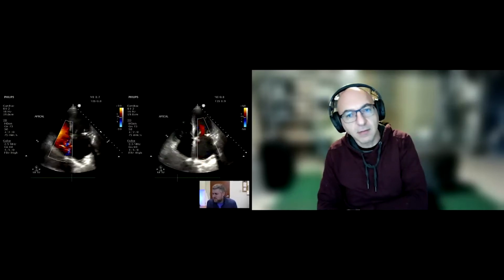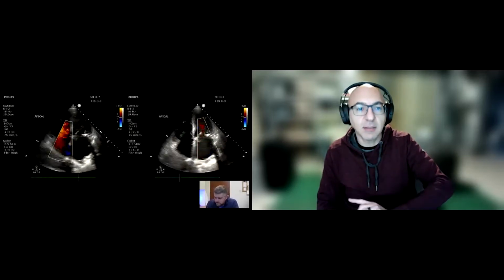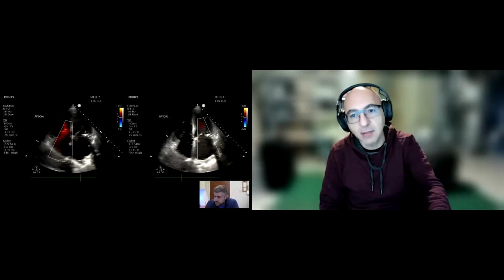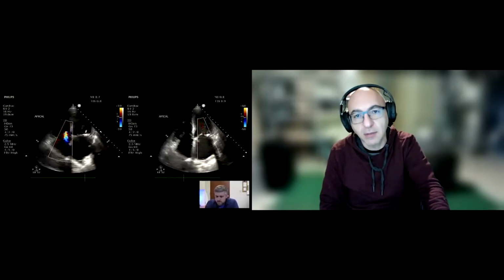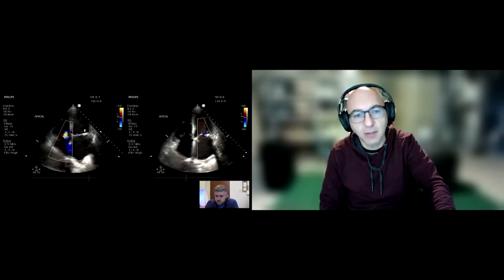Oh, yeah, definitely. I mean, you get the patient who's got lower extremity edema, you look at the IVC, and the IVC is big, and then you translate this to pulmonary edema. But in reality, the right side is a reflection of what's going on in the lung, not the cause of what's going on in the lung. So evaluating the left side is probably more important to start with, and then you go to the right side.